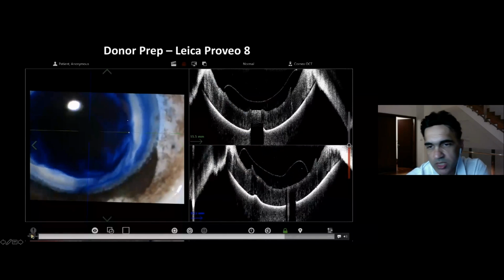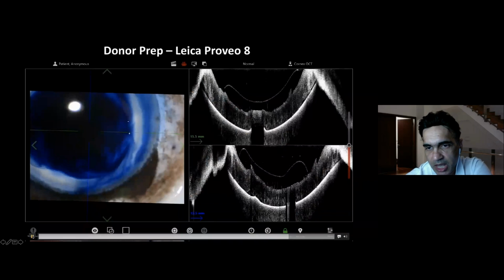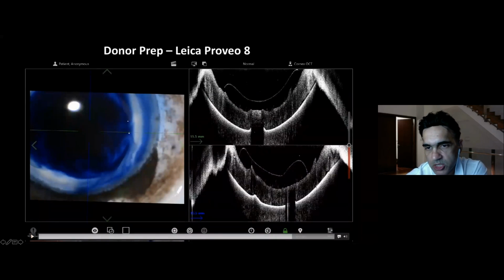And again, you can see on the OCT how much fluid there is on the surface. So your OCT penetrates through the membrane blue, and I can see this line over here and this line over here on the horizontal scan on this side, and this is your fluid over the DMEK tissue. So I've got fluid under the DMEK tissue. I know it's not going into a coil configuration, which would make my surgery a lot more difficult, but I know there's enough fluid there that the graft is being covered both on the top and on the bottom. And that's important that you make sure you get a coverage of the membrane blue or the vision blue on both sides of the tissue.